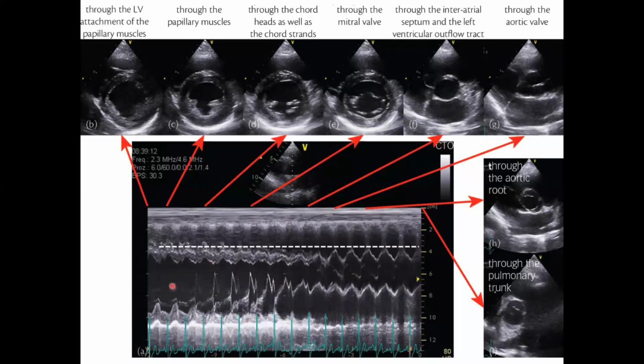This one is the central line of this thing here. Okay, so forget about all this stuff out here. We're just going to measure this central line. And you can see this part here, that feature is when this piece of tissue moves in.